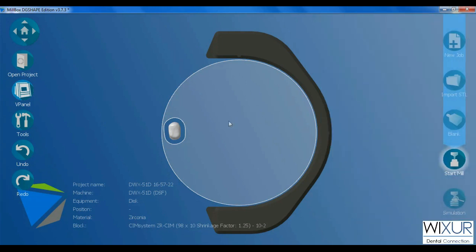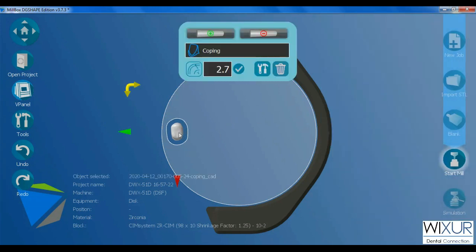If I click on the crown, a window with some options pops up. A pin with a plus mark is for adding connectors, and the one with a minus mark removes all connectors.